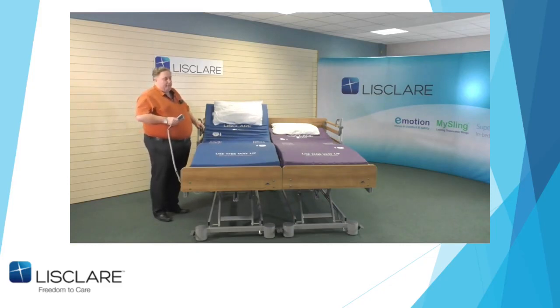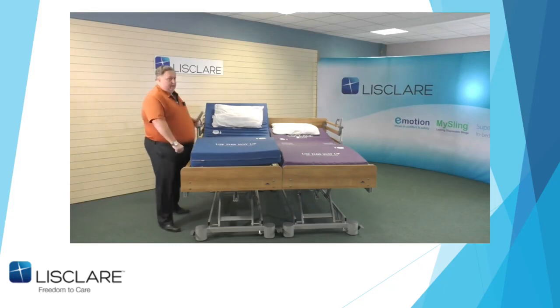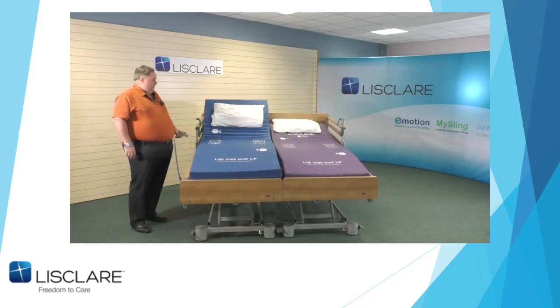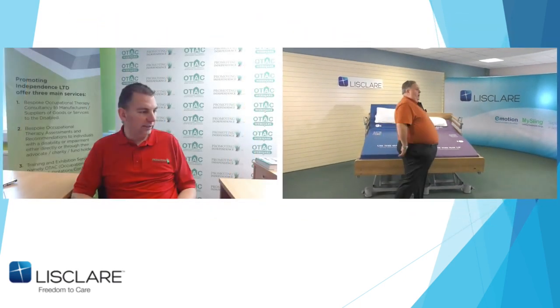If I lift the leg rest up, the feet stay down, okay? Which you can clearly see at the end of the bed. Now, hopefully you'll hear the 3 clicks here. So when you lower it down, there's the first click, there's the second, there's the third. Press back up, lift feet. So I haven't physically lifted the feet. A lot of people don't realize you can do that with nursing beds. And then obviously the variable height motor comes into itself, and they both go into the chair position, as you can see, but that's out of health and safety again. Hopefully that makes sense. But in our in-bed system session, the one we're doing in 2 weeks' time, I'm going to really focus on profiling a bed.